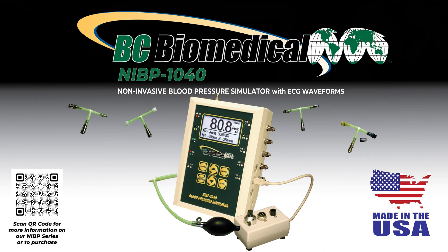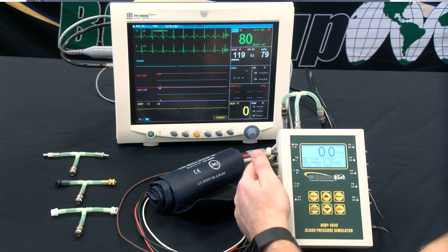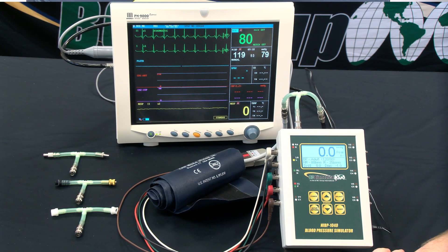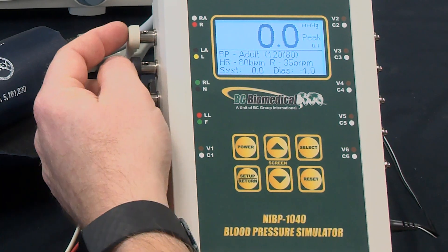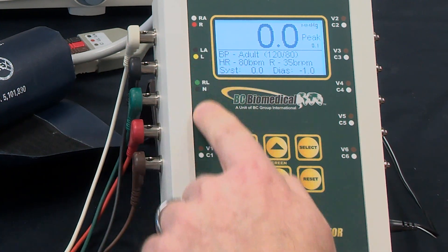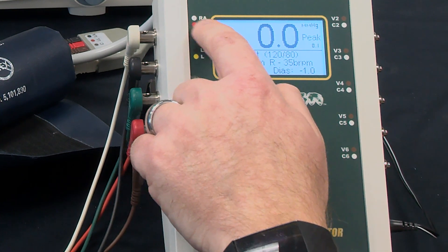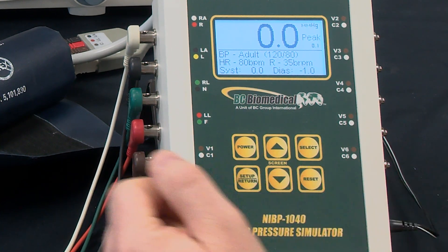In this case we're testing a Mindray PM9000 and we have the five ECG leads hooked up. This is also compatible with three lead ECG or all the way up to a full 10 lead ECG. We have the colors using the US color scheme, and on the front of the NIVP we also have the international color code listed underneath the US, with the color code and the lead name on each position of the NIVP.